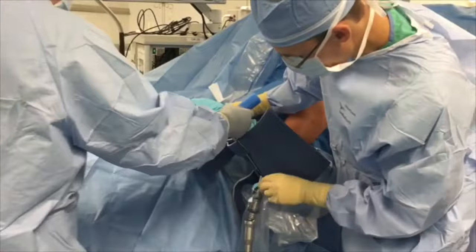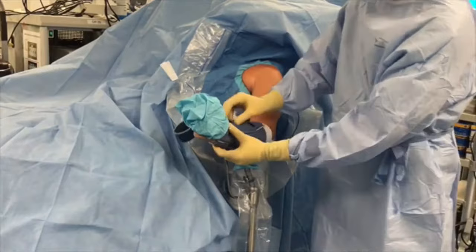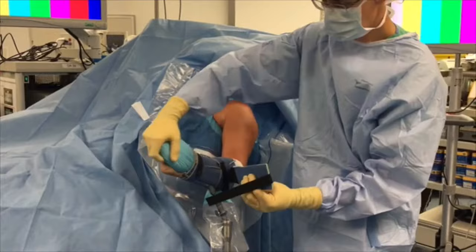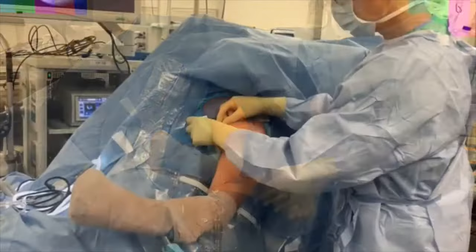The operative extremity is then placed in a padded arm holder that connects to the Spider II limb positioner. Care must be taken to assure that this is locked in order to maintain fixation of the limb but allow full range of motion of the shoulder if needed intraoperatively. The forearm is held in place with a series of padded straps and then wrapped in co-band wrap made by 3M Healthcare.